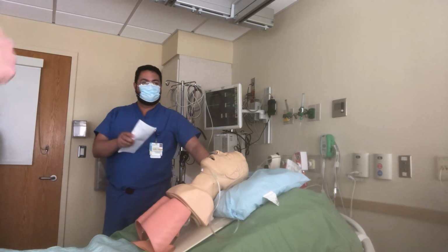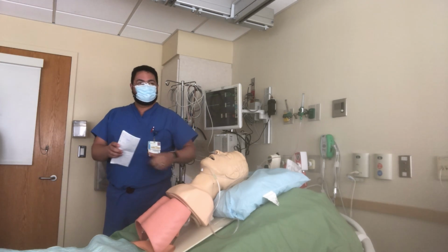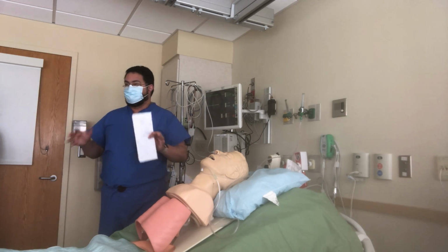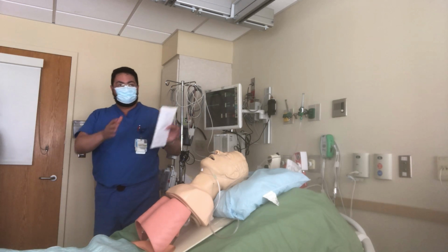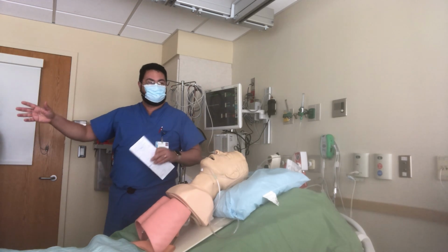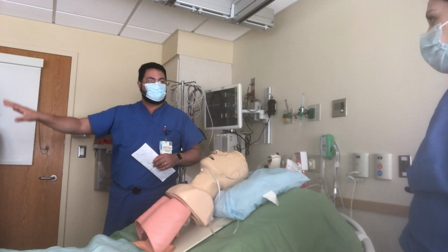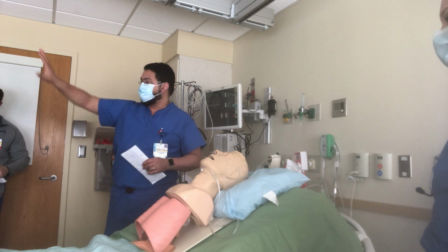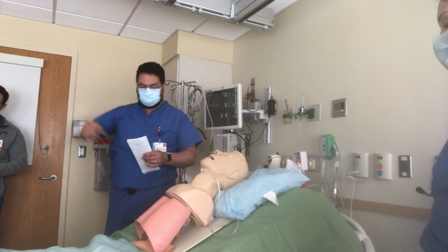While they're doing this, we would continue to suction and support the airway as best as possible. Everybody, we have to work in parallel. There's always a nurse assessing the patient who never leaves the room, but there's always somebody helping you. You don't ever leave the room to get something if you're the only provider and the only nurse. Other nurses are helping to get things from outside.